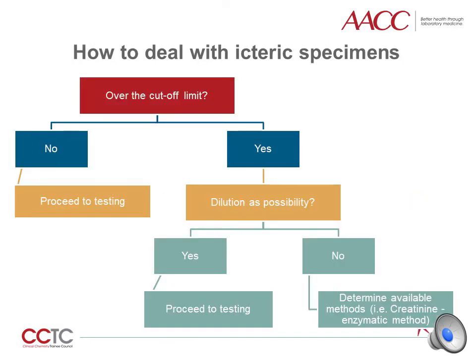One way to deal with an icteric specimen is to first determine if the I-index is above the icterus cutoff limit for the analyte of interest. If the I-index is not above the cutoff, you may proceed with testing. However, if the I-index is above the cutoff limit, determine whether you are able to dilute the sample by referring to the manufacturer guidelines. If dilution is acceptable, you may proceed to testing after diluting the specimen. If dilution is not acceptable, you will have to explore alternative methods — for example, using the enzymatic method rather than the Jaffe method for creatinine measurement.